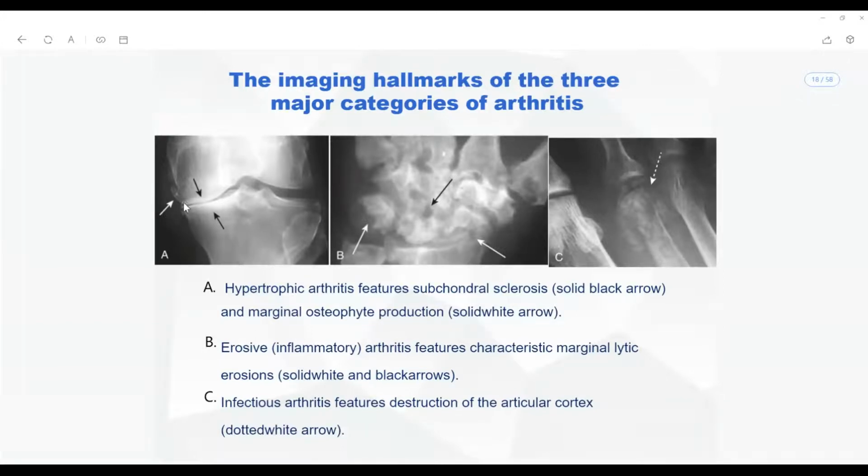Medial articular surfaces, there is a significant joint space reduction here, and I can also see a subchondral osteosclerosis. You see here, there is a subchondral osteosclerosis, and at the same time, I can see an extra bone growth formation here. So this clearly indicates that this is the osteophyte that is present here, with subchondral sclerosis, and a particular reduction in the joint space along the medial meniscus.